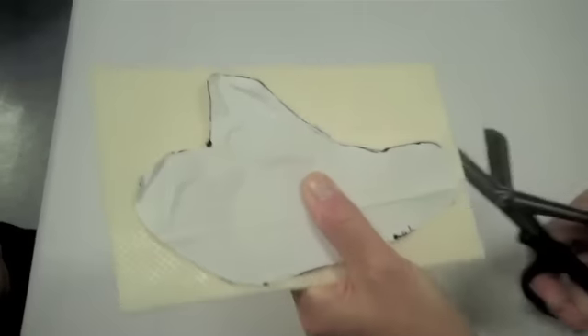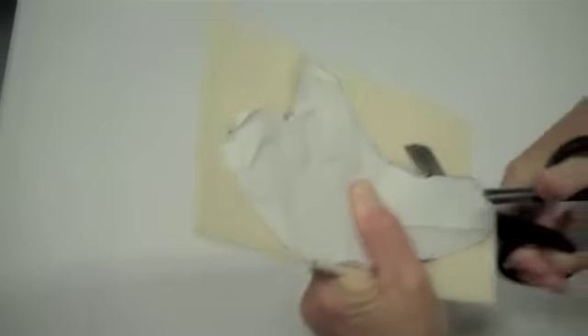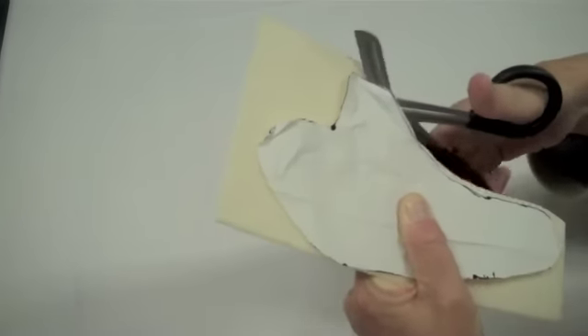Place the cutout pattern on a piece of ORFIT material and then cut out the pattern. Alternately, the pattern can be traced onto the ORFIT and then cut out.